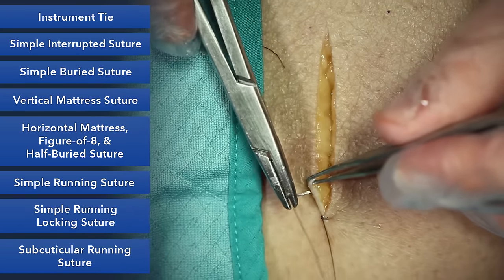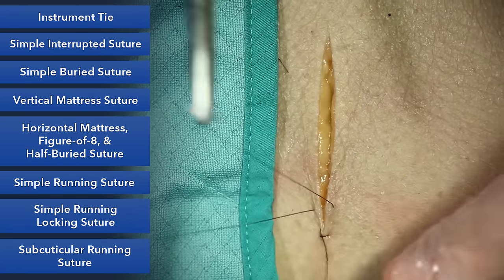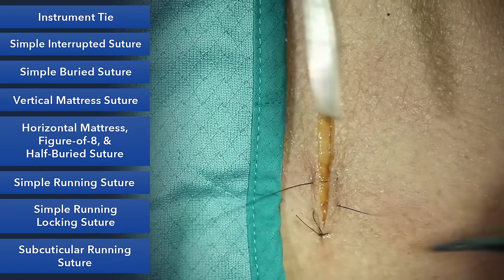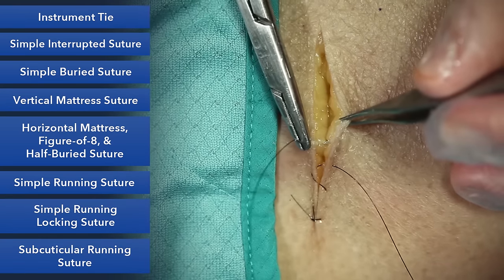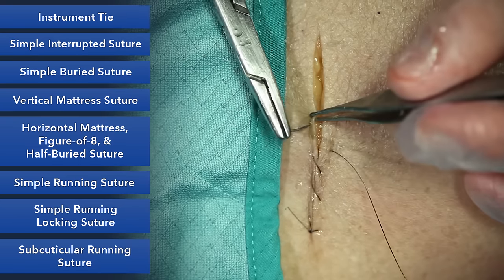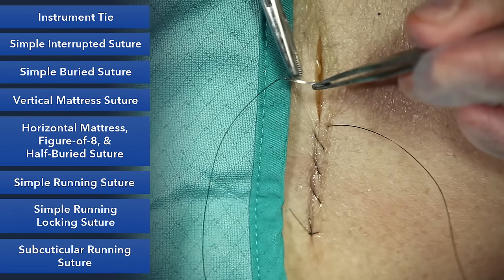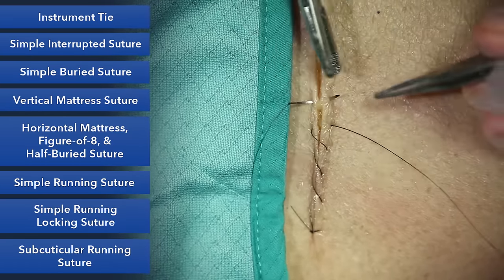You'll advance on the wound in symmetric fashion. Again, trying to take 90 degree bites each time. Try to move along at the same pace and same amount each time, almost mimicking a sewing machine. If you move along the same distance each time and take the same bites on each side, you have a beautiful cosmetic closure. People will ask, well, how much do you move along? My answer is, as long as it's the same on both sides, it'll end up looking very nice. So be consistent in your bites.